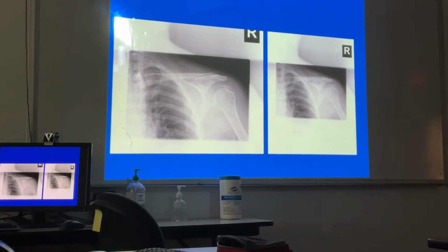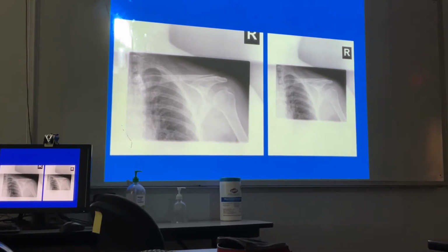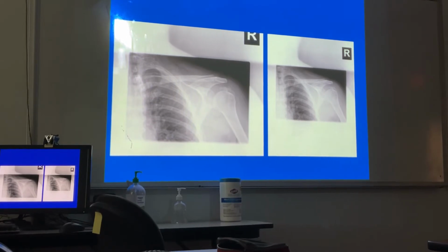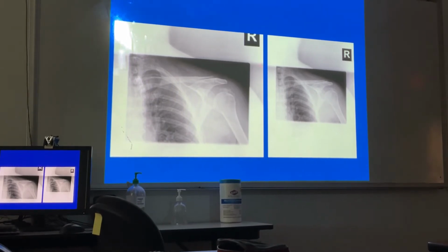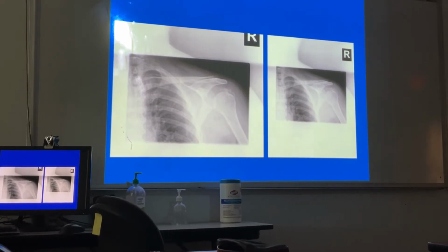Those are all cases. Yeah, okay, so, this is what? Well, first of all, which shoulder, which examination? Right shoulder. Shoulder, okay. Now, we see abnormality here, where is here? Glenohumeral joint. Proximal to the head of humerus, what lives there anatomically?